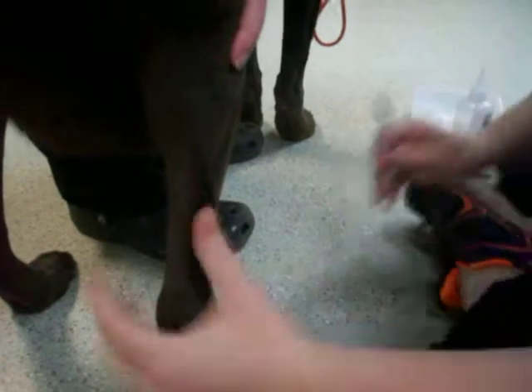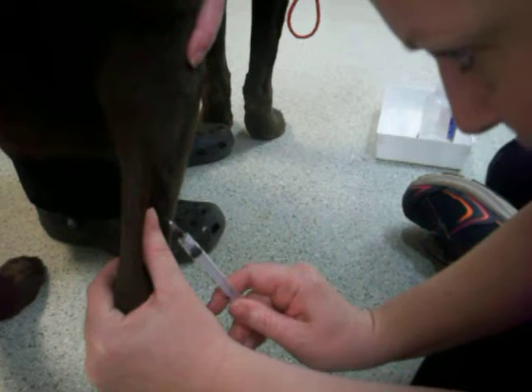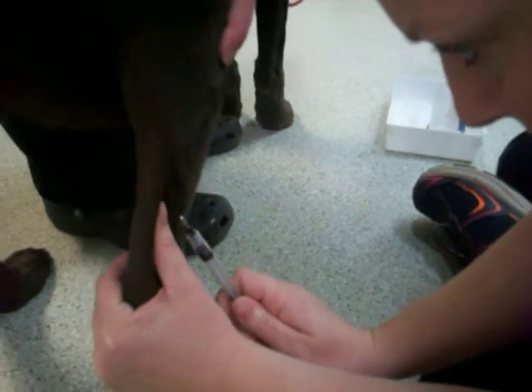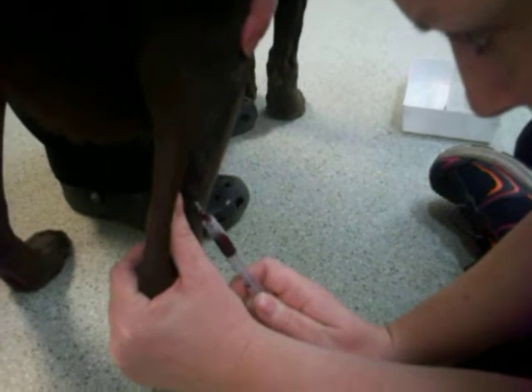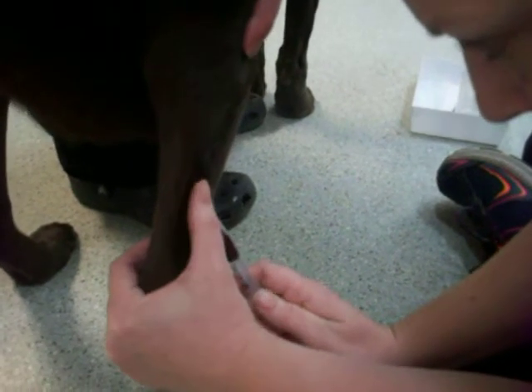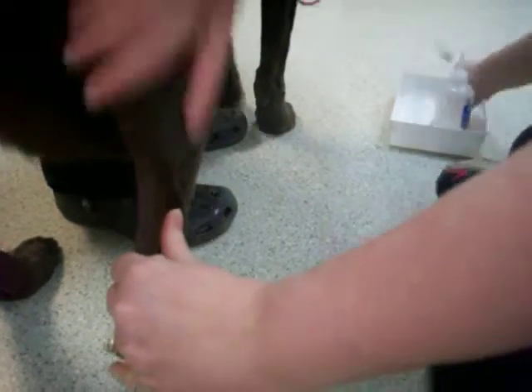We're going to use our thumb to stabilize the vein and insert our needle bevel up and gently draw back. Good boy. Then we'll apply some pressure to remove that, and then Tanya will go ahead and take over and we will put our blood into our tube.